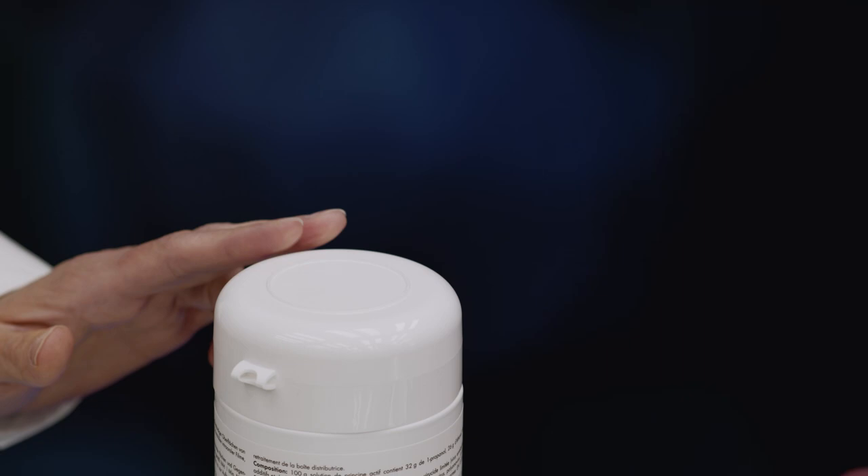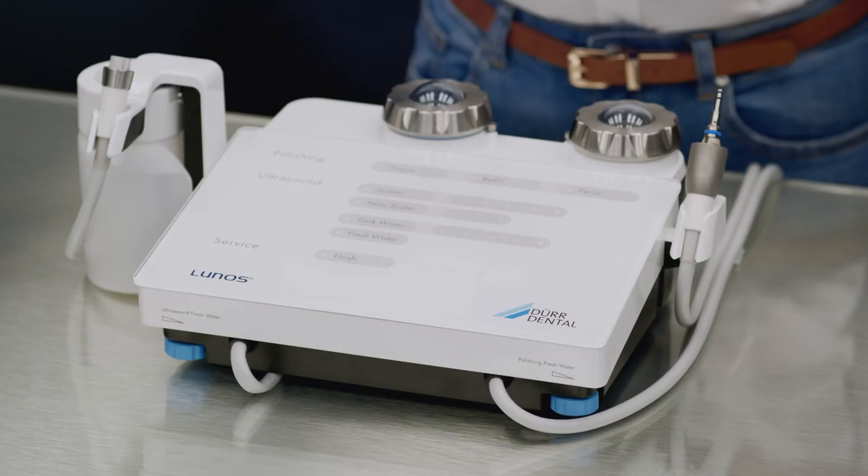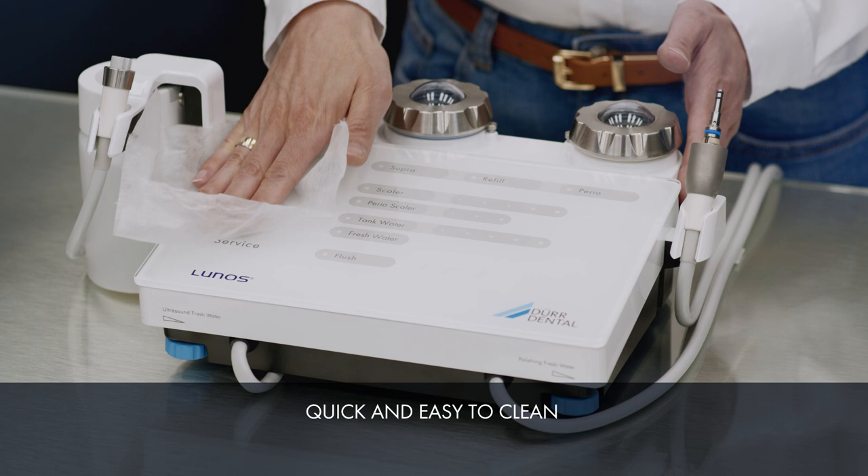Using the surface disinfection products from Durdental System Hygiene, the smooth surfaces across the entire device can be cleaned and disinfected quickly and easily.